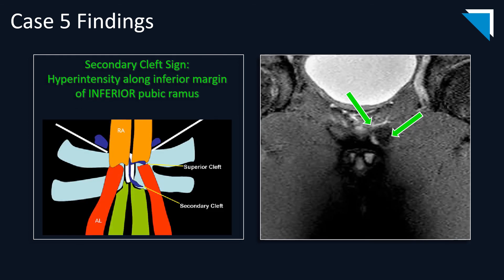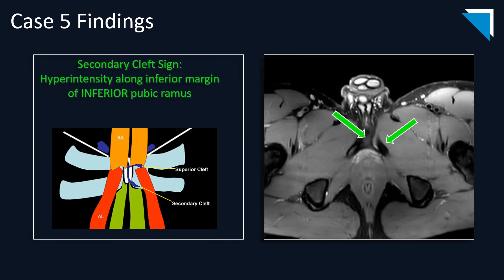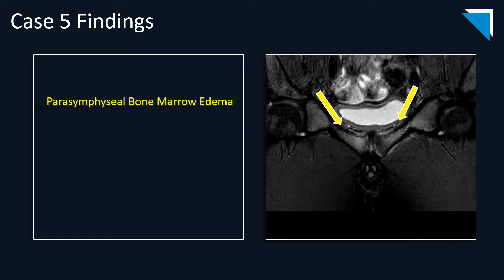A second sign in this case is called the secondary cleft sign — a curvilinear hyperintensity along the inferior margin of the inferior pubic ramus, as seen on the coronal and axial small field-of-view STIR images. As shown on this diagram, you can see both the superior cleft and the secondary cleft sign. You can also see parasymphyseal bone marrow edema.